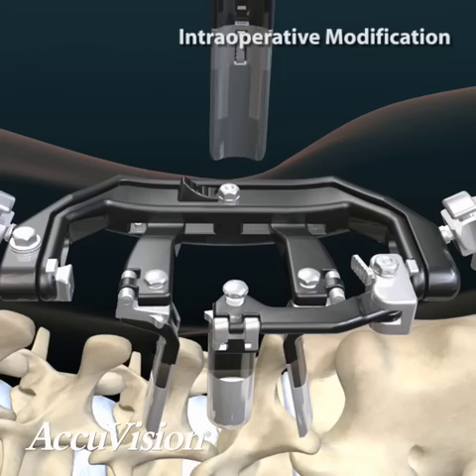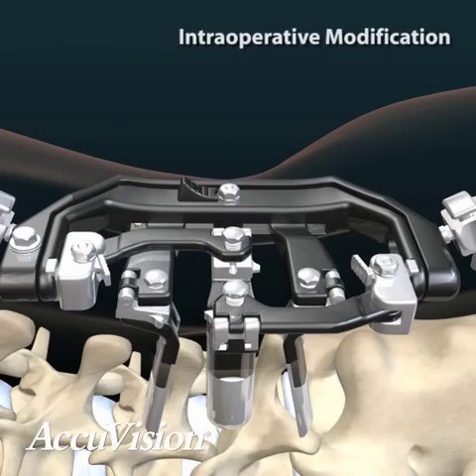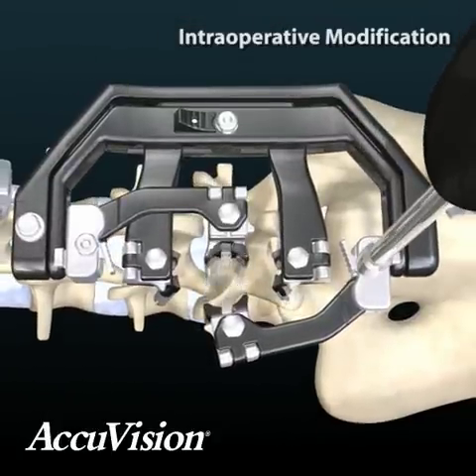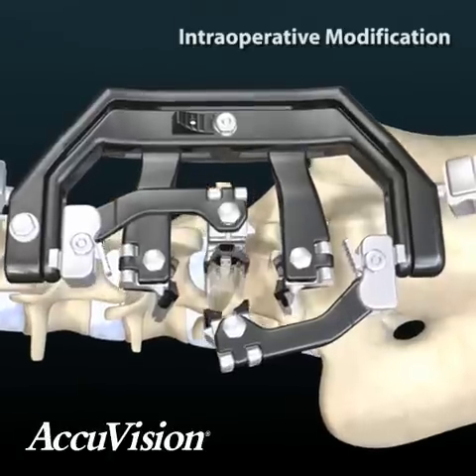Arm adjustments are made with the retractor wrench, placing it on the hex nut of the retractor arm and turning in a counterclockwise rotation. Additional retraction of soft tissue in the surgical site can be achieved by angulating out the distal end of the individual blade. Place the hex wrench on the hex nut of the retractor arm and turn in a clockwise rotation.